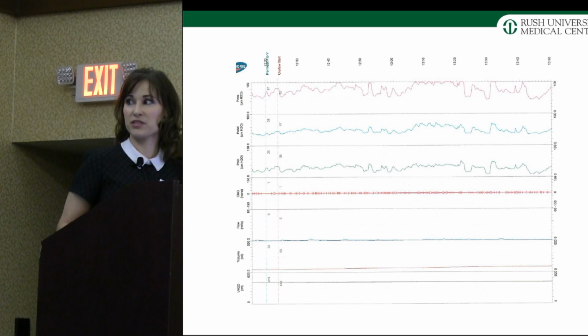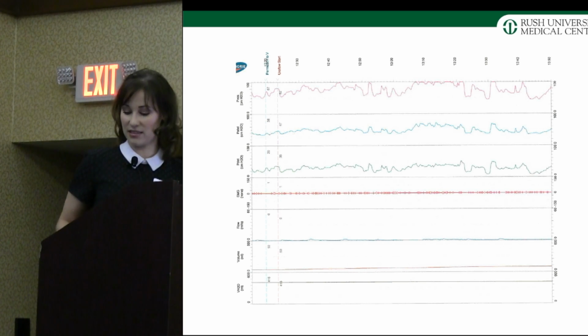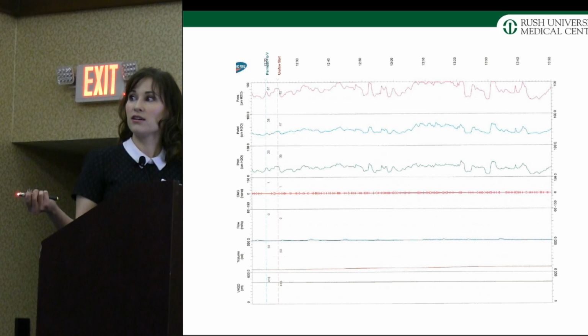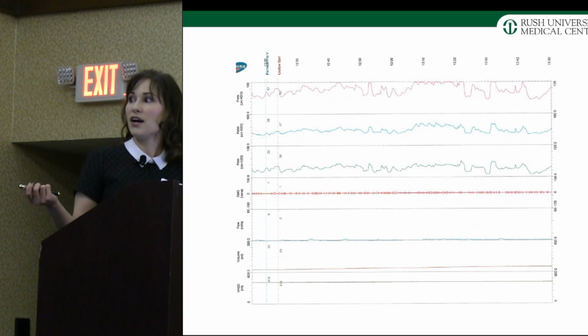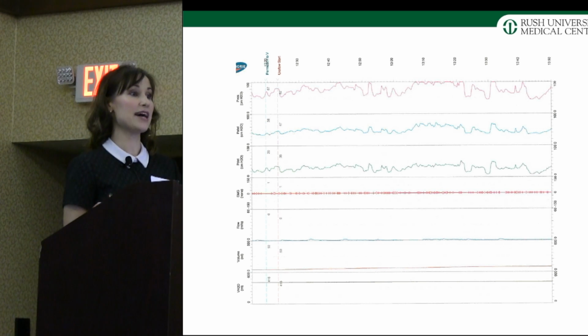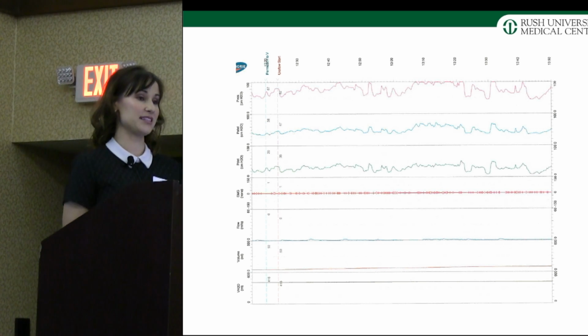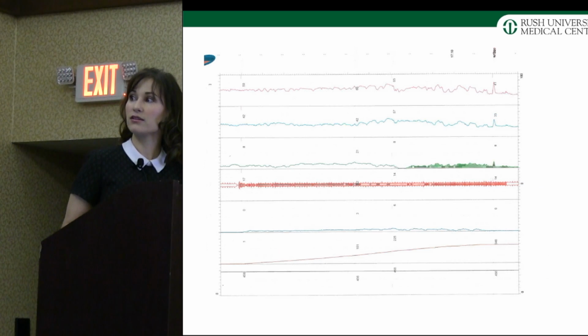So this is a patient who was given permission to void. Nothing was happening. So this gentleman started to use his abdominal muscles here in the blue to attempt to void. He's really working his abs to try to empty the bladder. And then you can see these little blips here, little flow, little flow, little flow. So he's not mounting any detrusor or bladder pressure of his own. He's using his abdominal muscles to squeeze that out.